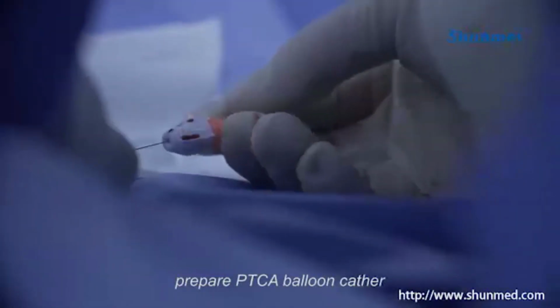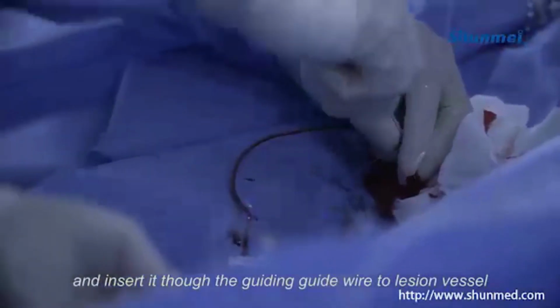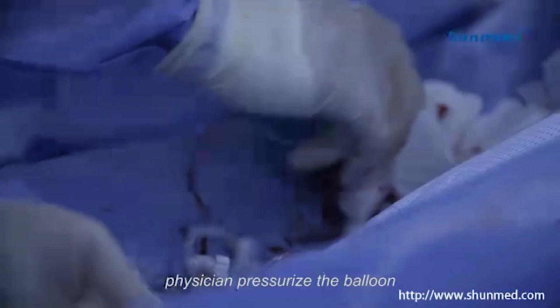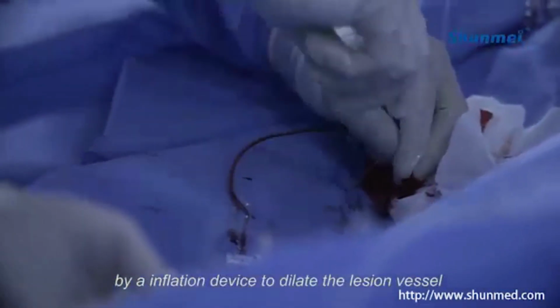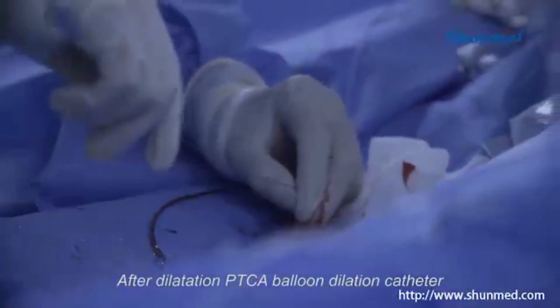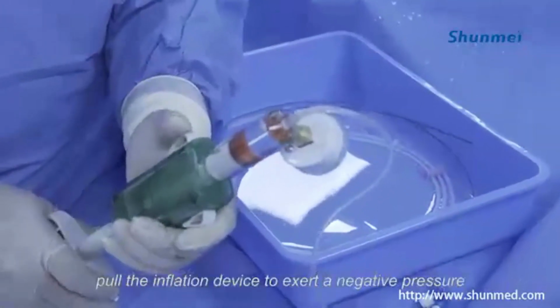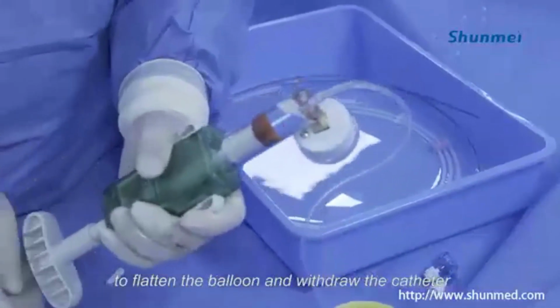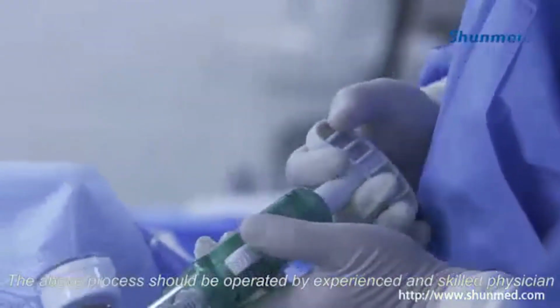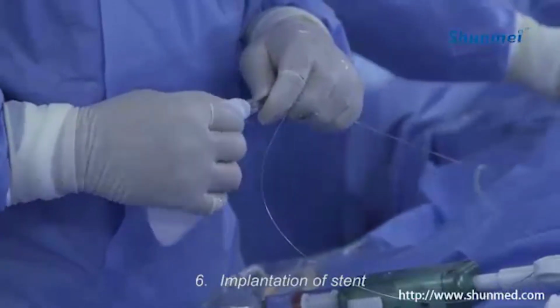After that, prepare the PTCA balloon catheter and insert it through the guiding guide wire to the lesion vessel. After the PTCA balloon catheter reaches the target site, the physician pressurizes the balloon with an inflation device to dilate the lesion vessel and construct a channel for placing the stent. After dilatation, pull the inflation device to exert negative pressure to flatten the balloon and withdraw the catheter. The above process should be operated by an experienced and skilled physician.